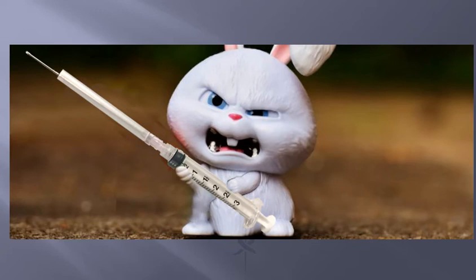Then I read about a technique from the folks at Massachusetts General about using a submandibular approach to make a diagnosis and aid drainage of these abscesses. For several years, other authors have discussed using an intracavitary probe for this, but not all of us have an intracavitary probe, and logistically it always seemed a little bit tough to me to imagine taking some poor trismus-affected patient and sticking an intracavitary probe, your hands, a needle, and possibly a tongue blade of some sort in their mouth.